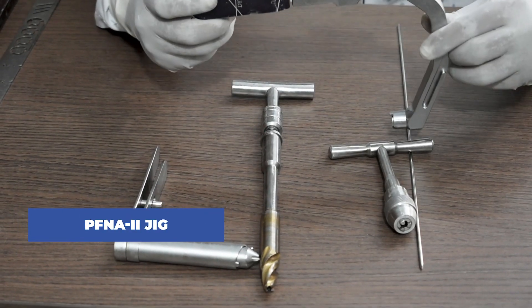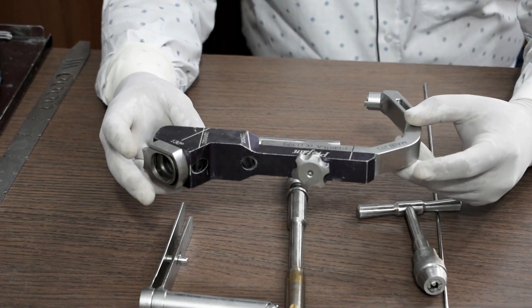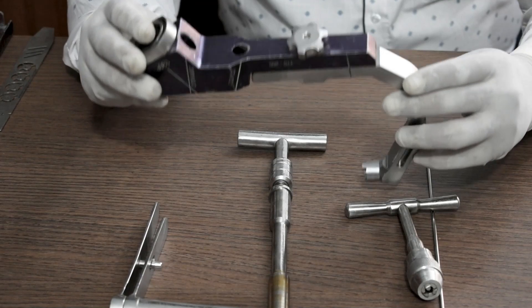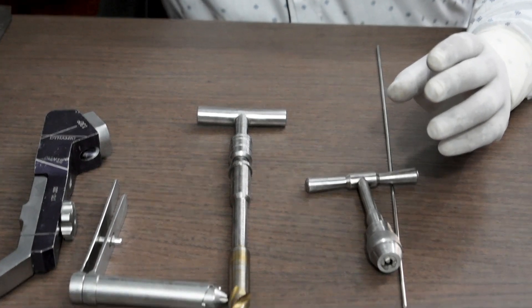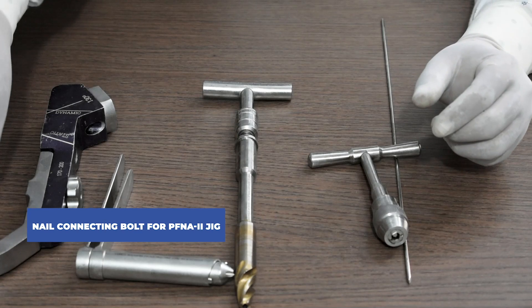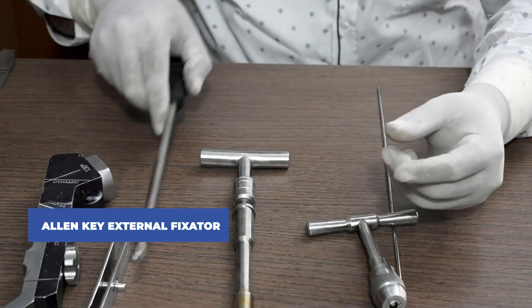This is the PFN A2 jig — one of the most vital pieces of equipment for the surgery. We will discuss the use of this equipment in a later video. With this jig, you will also require a nail connecting bolt for the PFN A2 jig.